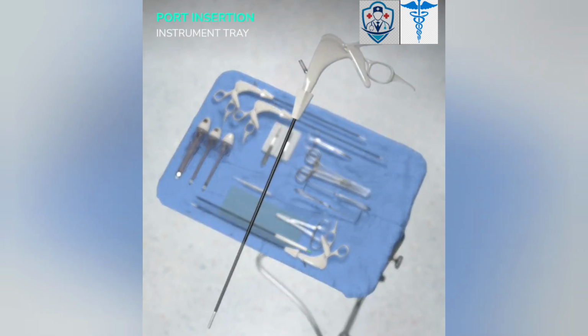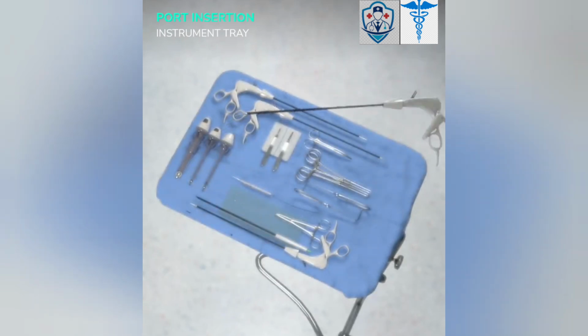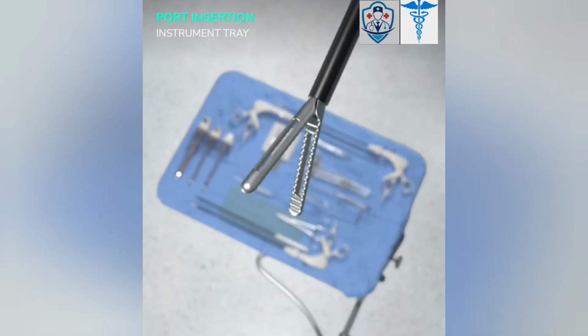The atraumatic graspers have serrated jaws. These graspers are used to handle soft tissue. The atraumatic fenestrated graspers are similar to the atraumatic graspers. They can be differentiated by the window along the length of the jaws. These graspers have a similar function to the atraumatic graspers and are used to handle soft tissue.